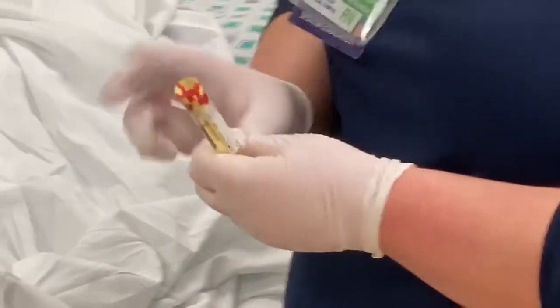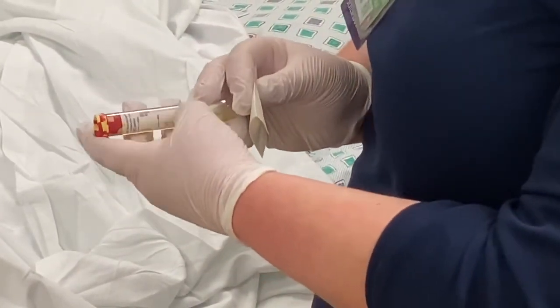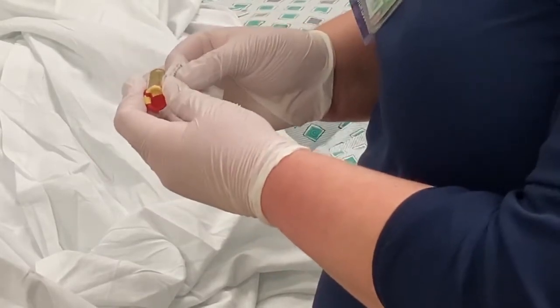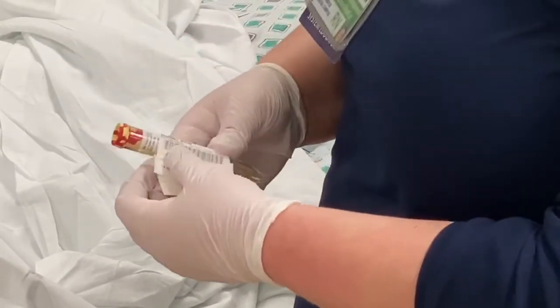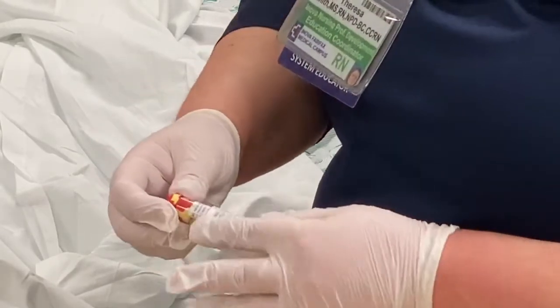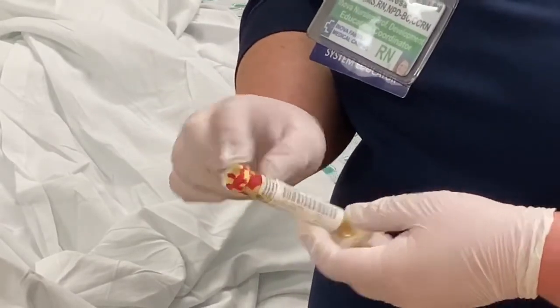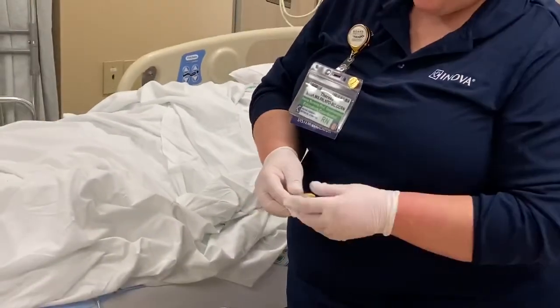So what I'm going to do is prepare my label, and then I'm still going to line it up with the manufacturer's label, but I'm going to line it up right below that max line. So when I put it on right here, you can still see the max line on the tube. Okay, so now my tubes are labeled.